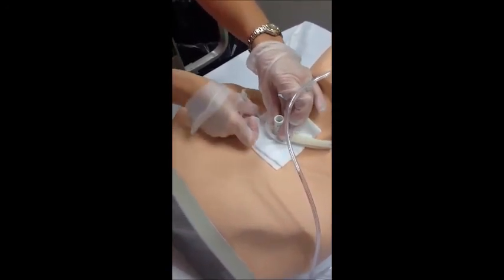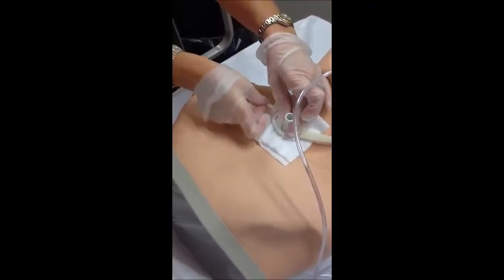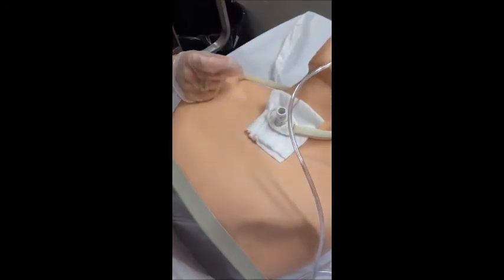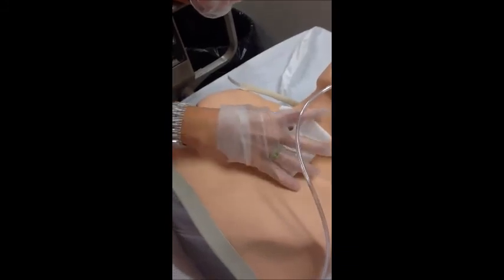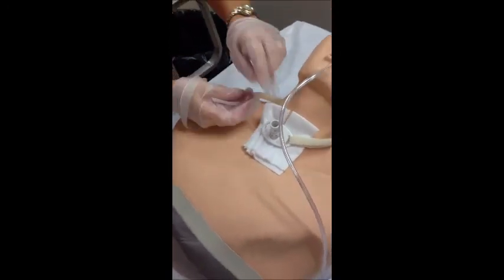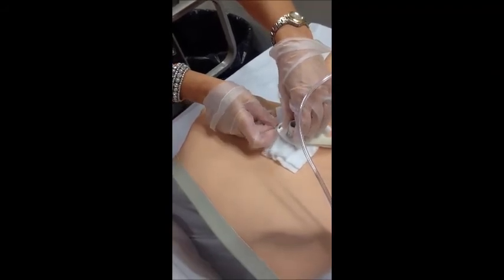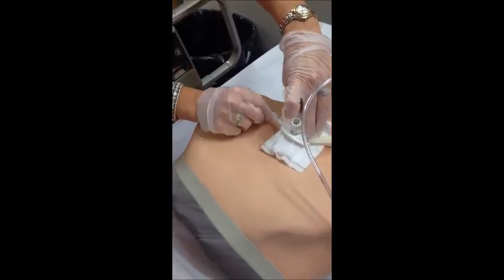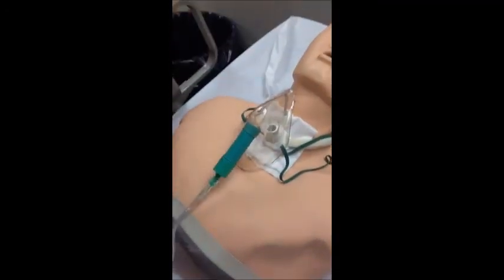The biggest thing about the last little step in this whole process is keep one hand on the faceplate at all times. Because if I take my hand off right now and I have that tie loose and they cough vigorously, this whole thing is going to fly like a missile across the room, and then I've got a patient with an unsecured airway. Hand on the faceplate. This is not the most comfortable thing for your patient, so just try to be gentle. Oxygen back on, and then there's the documentation piece.